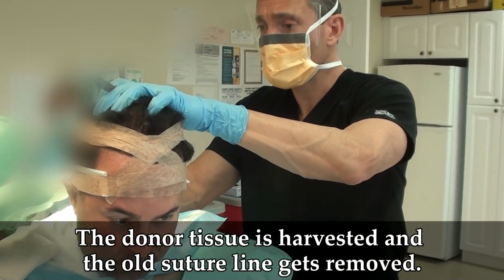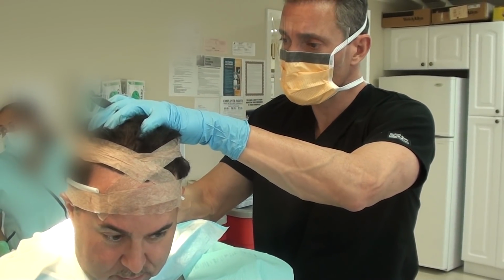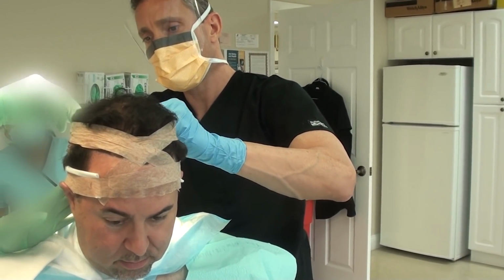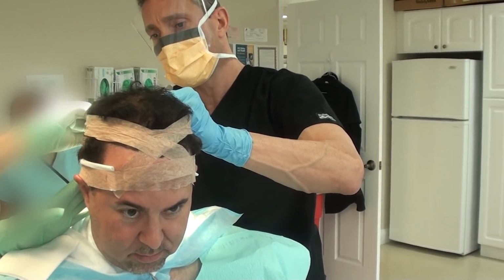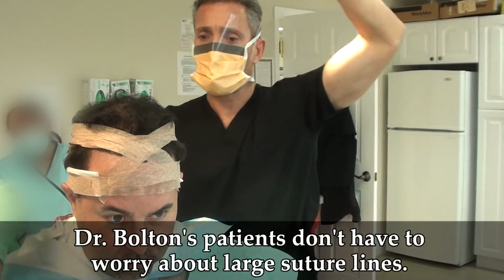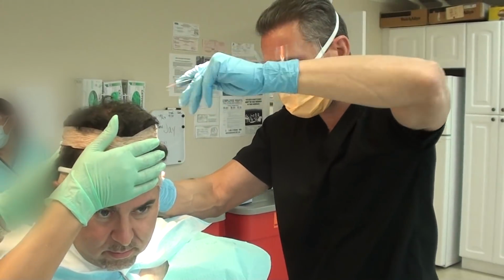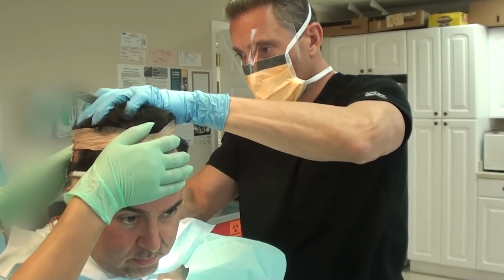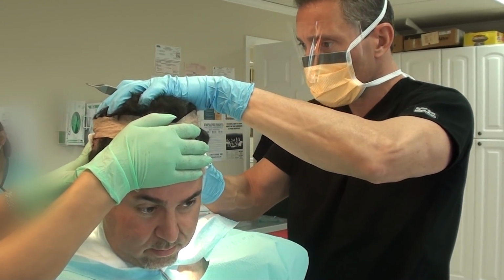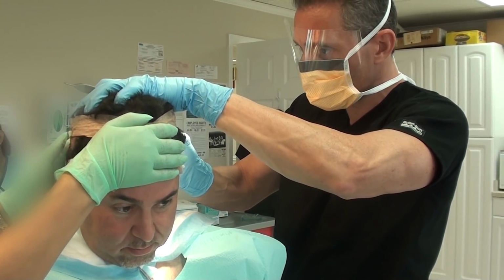Right now what we're doing is we're harvesting the donor tissue. We're excising the old suture line, so that way we're going to leave Jay with just the one suture line. So even though it was a great suture line, we're going to remove it. That way if Jay chooses to cut his hair short, he'll just have the one trace line, which a lot of the guys today are so concerned about suture lines. Which for the life of me, I don't understand why, but I get it. But at any rate, all we're doing is just harvesting the donor right now.